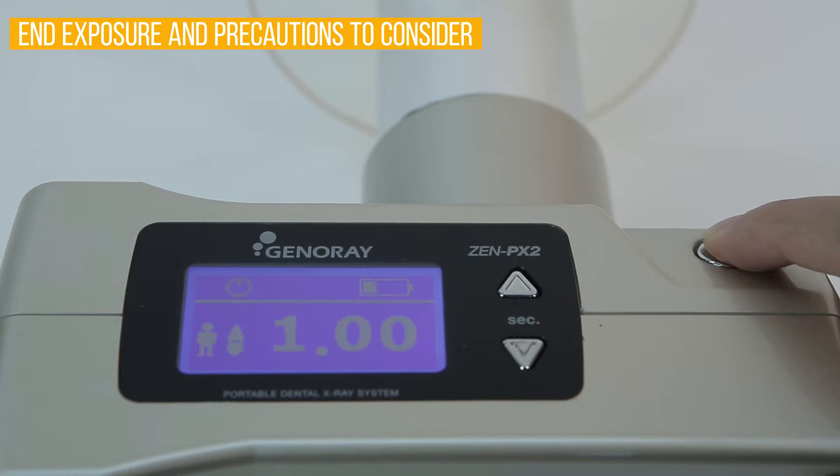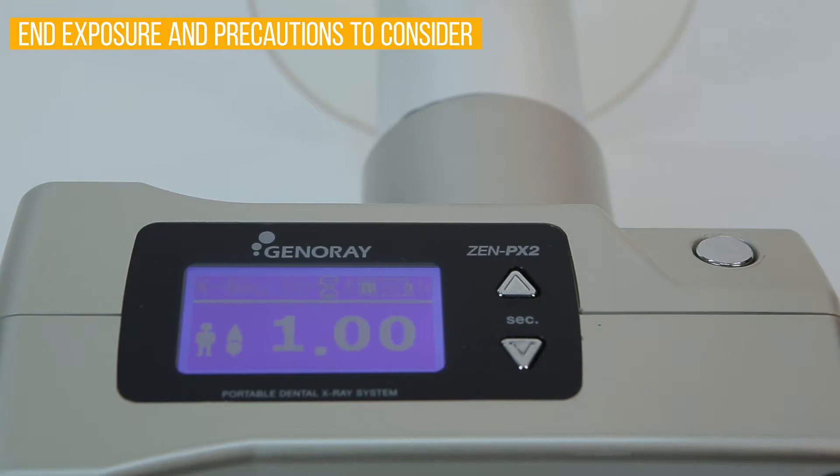If exposure is not complete and you let your finger off the exposure button, a 'not enough' warning will appear on your LCD screen. Be cautious that if there is not enough X-ray, the acquired image will be blurry.